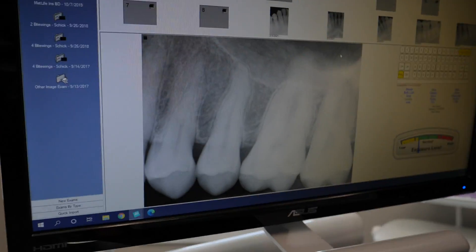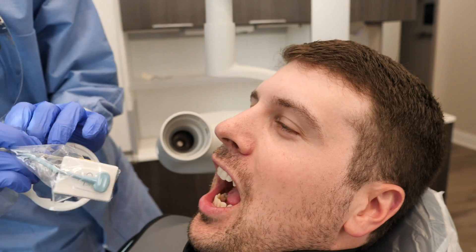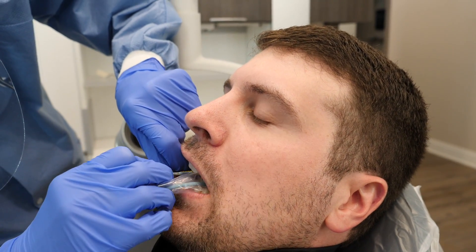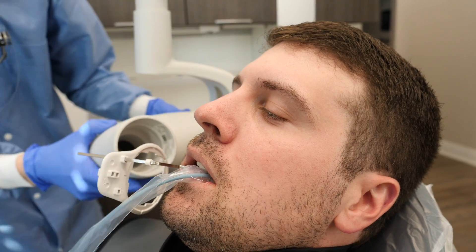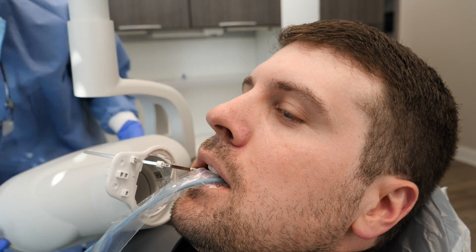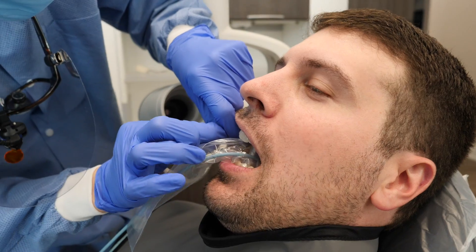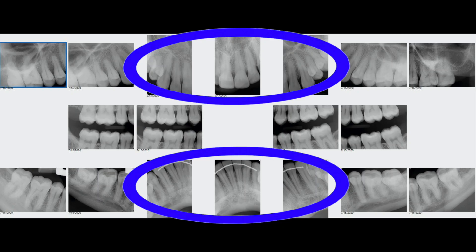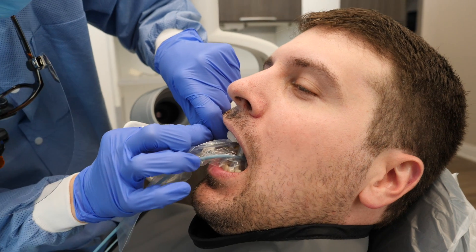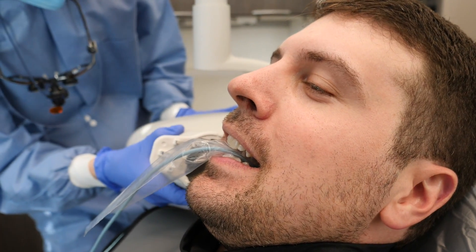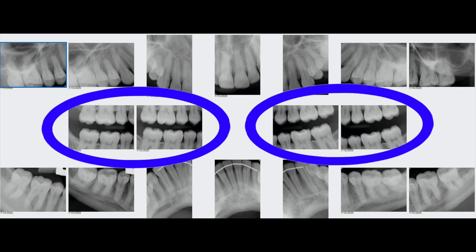Let's watch the remaining images of the posterior PAs be taken. After we finish the PAs we will move on to the bitewings, which you will see at the end. Something to note: most full mouth series x-rays are about 18 images total — six anteriors and eight posteriors — and then we'll finish up this last x-ray and set up for the bitewing x-rays.